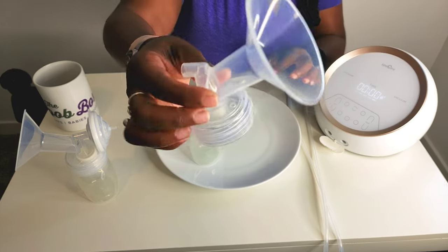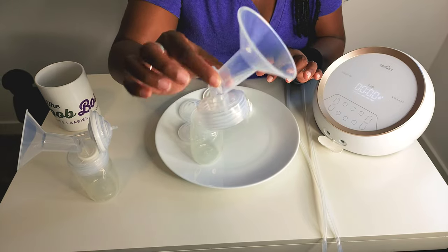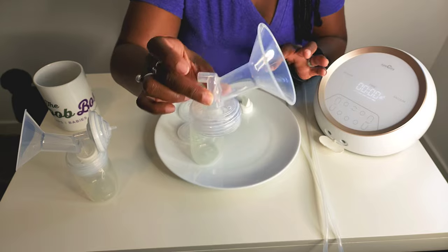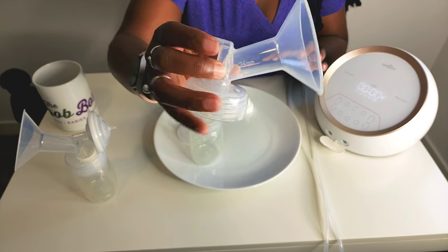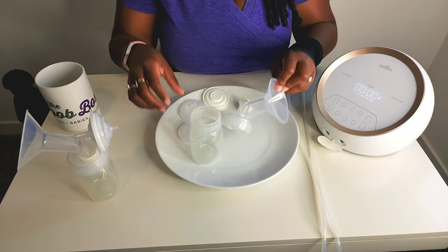This is your flange piece. Spectra has one complete flange piece. This can make it a challenge sometimes getting it into a breastfeeding bra, but a lot of the pumping bras now expand enough to allow you to put the flange in, even though it is one piece. I'm going to be using a 24 millimeter flange, as you can see here, to pump.